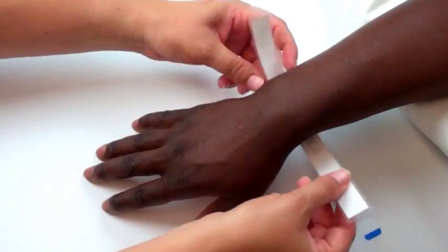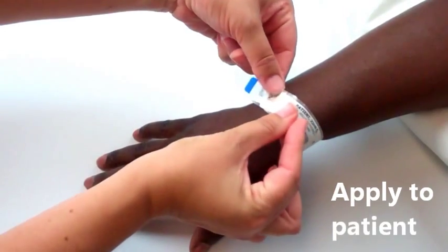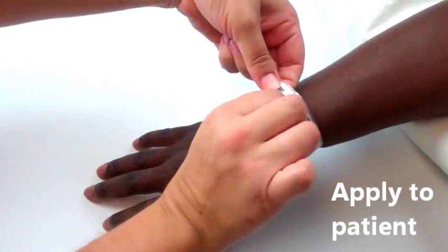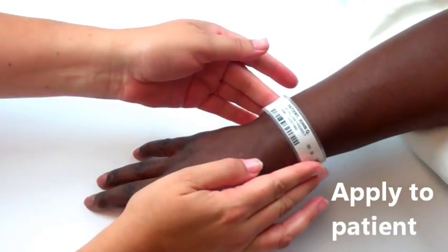Apply the band to the patient with the patient information facing outward, leave one finger space for comfort, and seal with the adhesive closure.